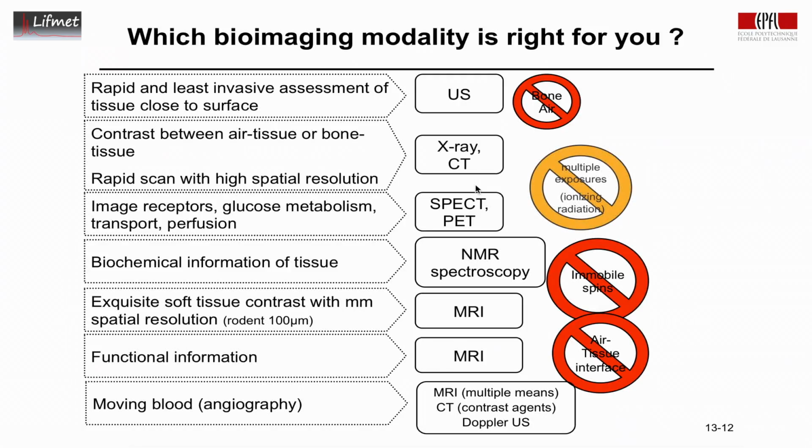We have to consider some limitations for the X-ray techniques, and that is multiple exposures limit its applicability. You do not want to go 10 times a year into a CT scanner if you're a healthy young volunteer. However, if the condition is life-threatening, it may matter less. I'll come with an example. And for everything that is with magnetic resonance, we have to consider that we have a big magnet. If you carry a pacemaker, an insulin pump, a defibrillator in your body, or metallic implants, then this is not the technique for you to be used. You're excluded from this technique.